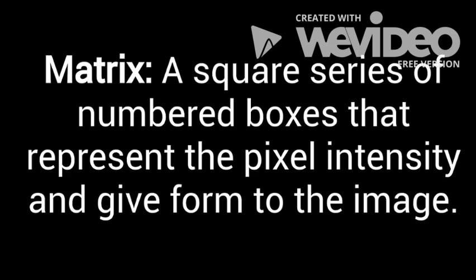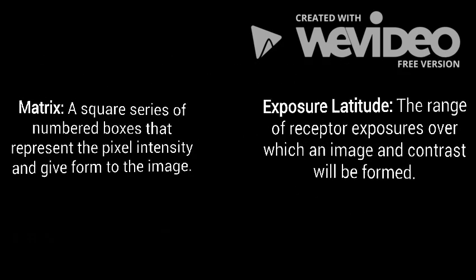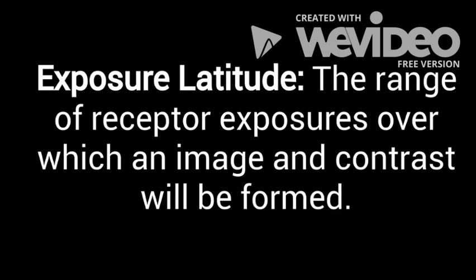A matrix is a squared series of numbered boxes that represent pixel intensity and give form to the image. The exposure latitude is the range of receptor exposures over which an image and contrast will be formed.